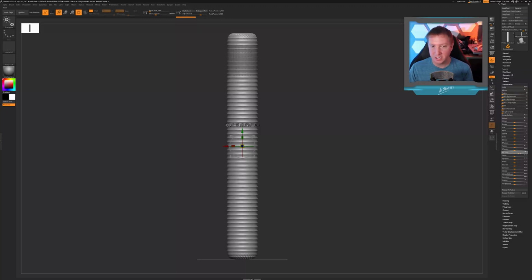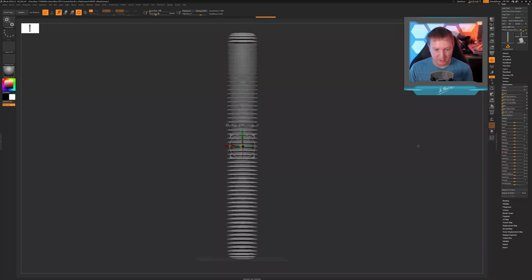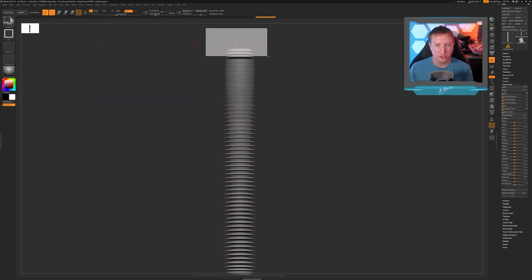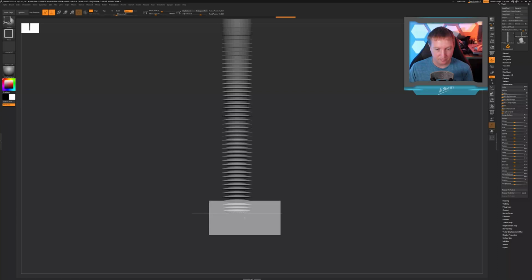All right, so I'm going to keep twisting this until we get some really nice deep threads, because I want to see the full shaft of the screw through those threads. So I need to keep twisting. All right, that looks pretty darn good. Okay, now that we've got that done, I'm going to come up here to my brush menu, and I'm going to chop off the ends of this. So I'm going to do trim rectangle, and click OK. I'm going to hold Control Shift and lop off the threads on the top and the bottom here, which we don't need. Okay, maybe one more thread I'll take off.